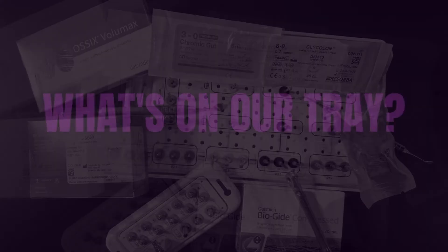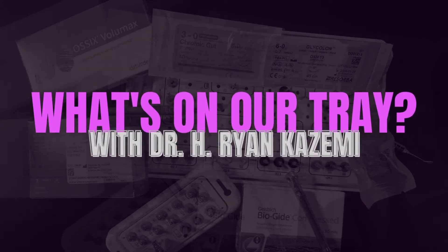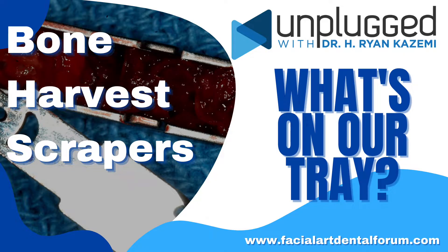I will show you the two most common types of bone scrapers and how we use them to get the bone that we need. There are primarily two ways to harvest particulate autogenous bone: either with bone scrapers or with special bone harvesting rotary drills. Today I'm going to focus on bone scrapers, which I prefer for a couple of reasons.